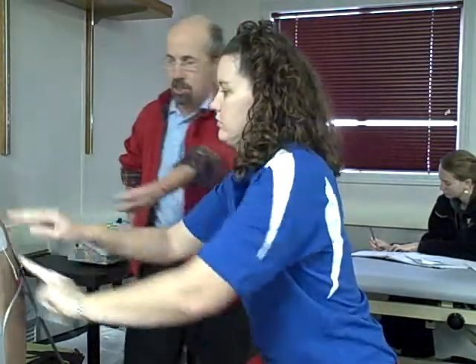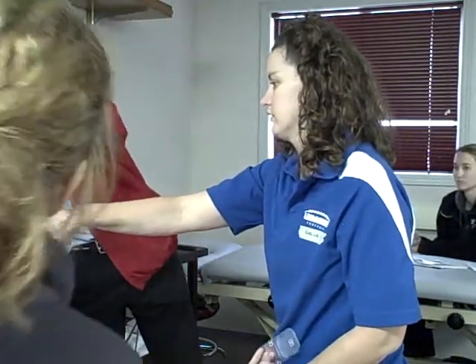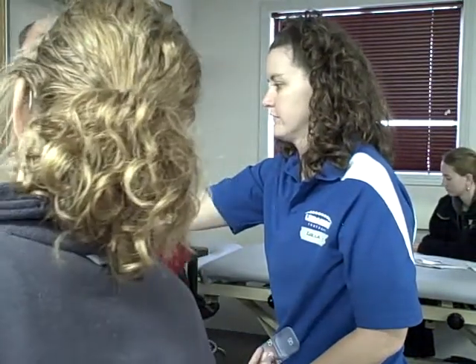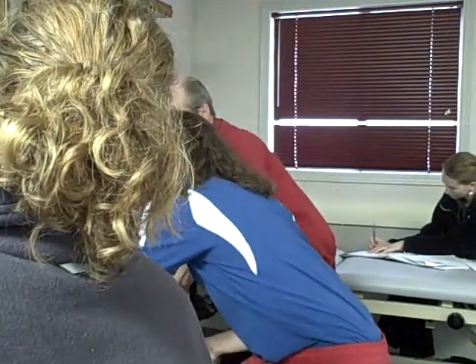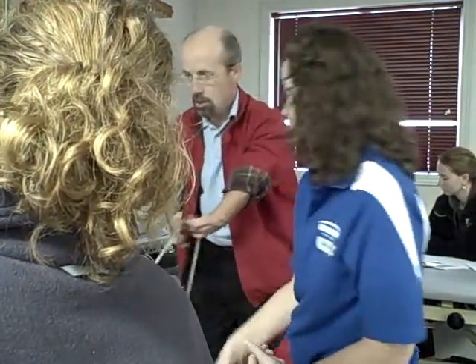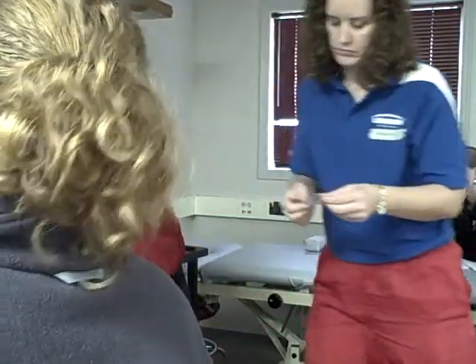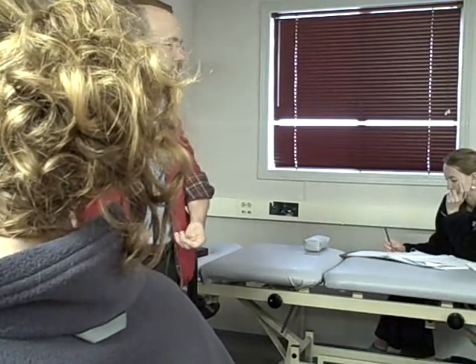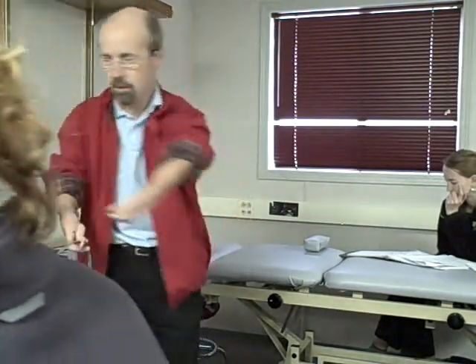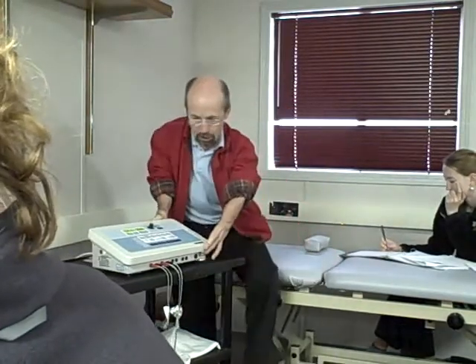So I want to speak a little bit about the modes. This is very common, very good. So this is the area that we're shooting for. I call it the jackhammer. That's two channels, kind of a jackhammer. Normal. So here's channel 2, and channel 1. There are other electrode configurations, but far and away this is the most common setup. Sensations running together, modulated. Gently within a range, so it kind of ebbs and flows.